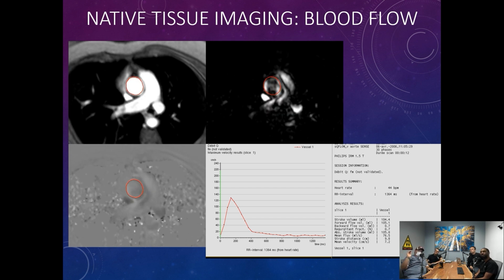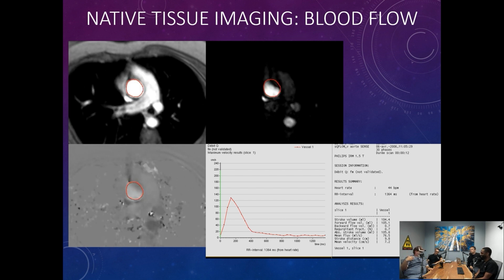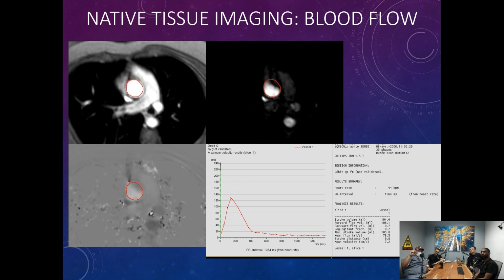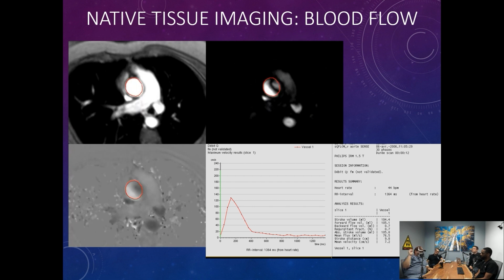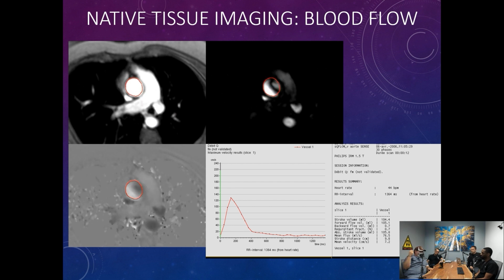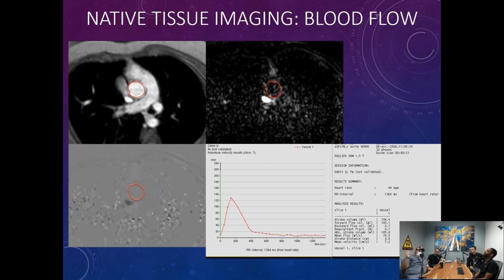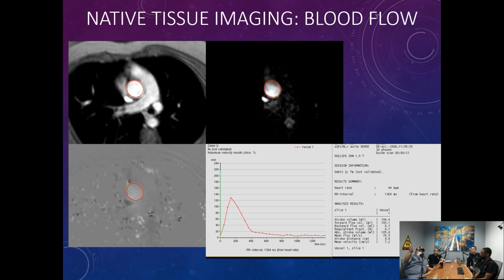And it would be ideal to look in three directions because we have three spatial dimensions, right? So you could go head, foot, left, right, front, back. And then by looking at, in any particular spot in your scan volume, any voxel, how that changes kind of up, down, left, right, front, back, you can actually take those three coordinate systems into account and get an actual true direction and velocity.